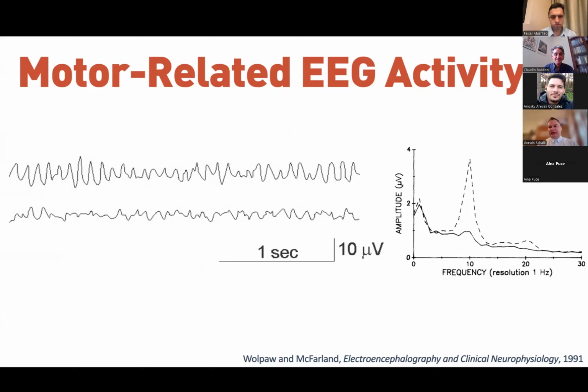The other thing is that the FFT is assuming that the signal is zero mean. Now, as you can see here, the top actually looks like sort of zero mean. This is the EEG, and it goes like that, and then sometimes it has higher amplitude, sometimes it has lower amplitude, and you can sort of imagine it being centered around zero. Then that's kind of okay. Well, but what if it isn't? What if it's biased? So what if when it's small, it goes like this, and when it's larger, it goes like that? Well, then the use of the FFT is really not very appropriate.